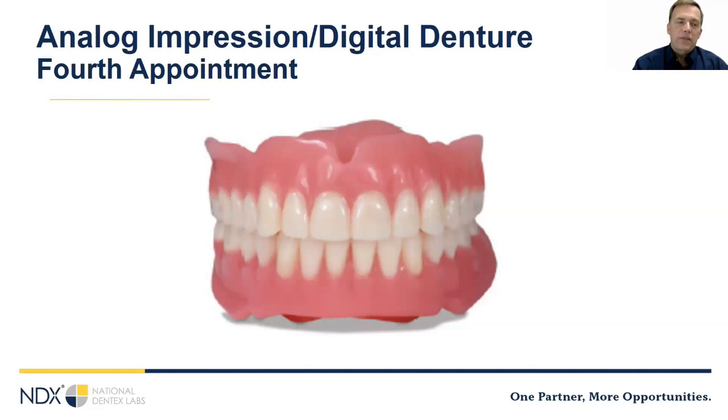Milled or printed teeth tend to be a little bit easier to use because a lot of times, as you know, with denture patients, we don't have a ton of vertical space, and you can't grind carded denture teeth. You have to have enough space for them. So sometimes your lab will start setting it up and digitally they'll say, oh, I can't use these. So I think we're seeing mostly lab manufactured teeth today. And again, just like with you, each lab is going to have a workflow that works best for them.